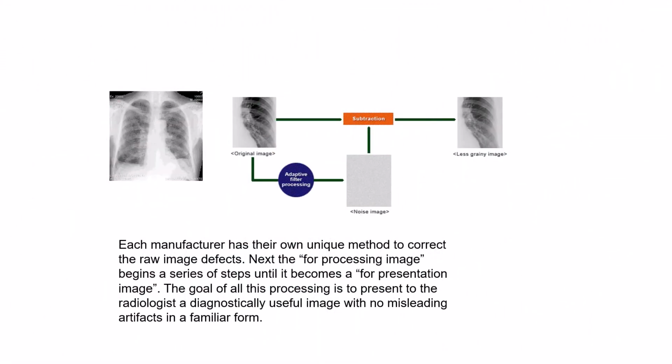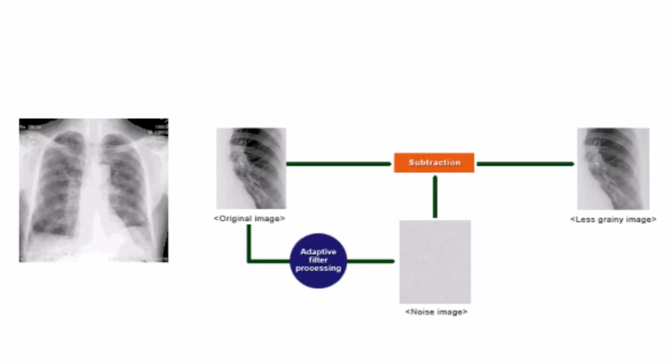Each manufacturer has their own unique method to correct raw image defects within their processing technique. The goal of this processing is to present to the radiologist a diagnostically useful image with no misleading artifacts in a familiar form.